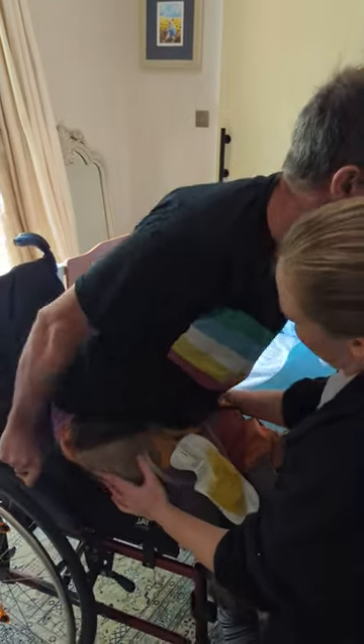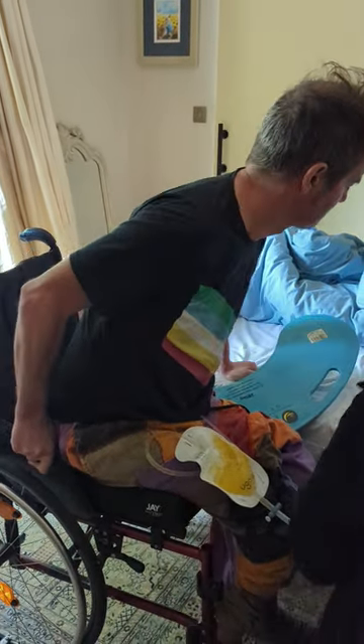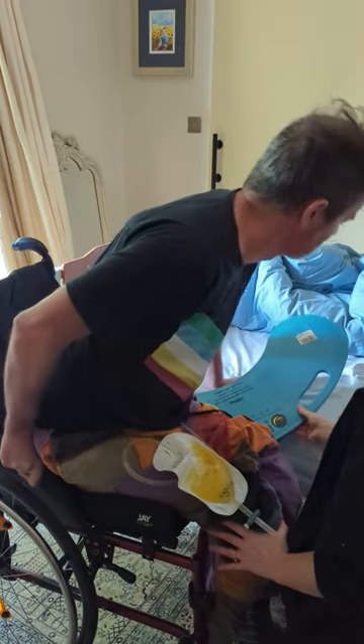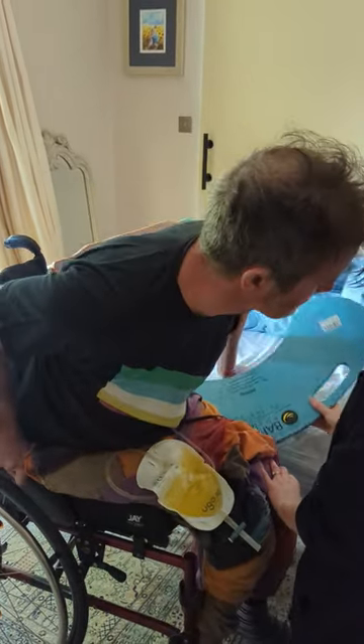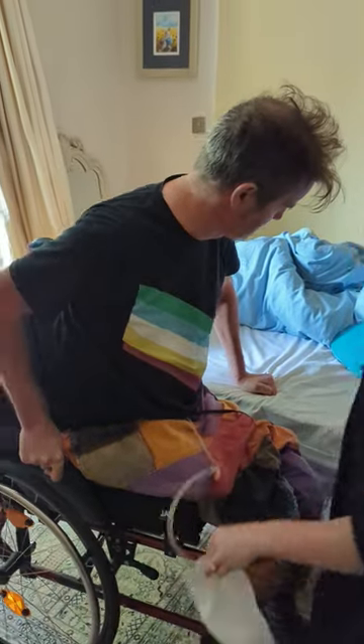Open that arm. Good. This is a safety concern — this is all about the rack, which is a risk problem. And then just bring it down. Perfect. Okay.